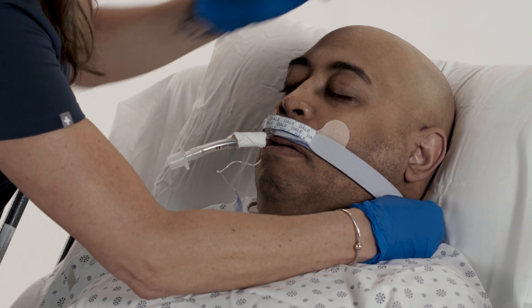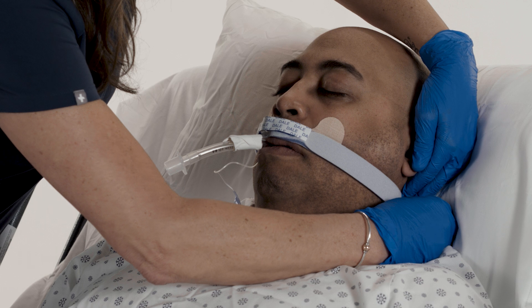Adjust the fastener tabs on the neckband for a snug fit as necessary.